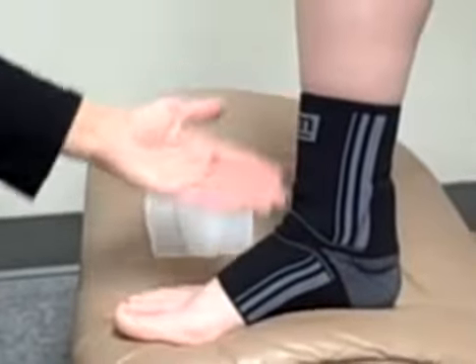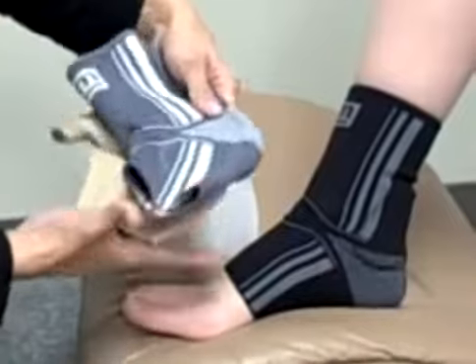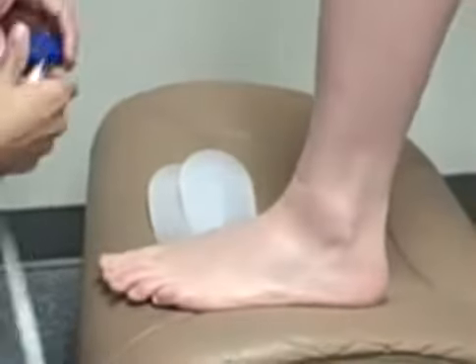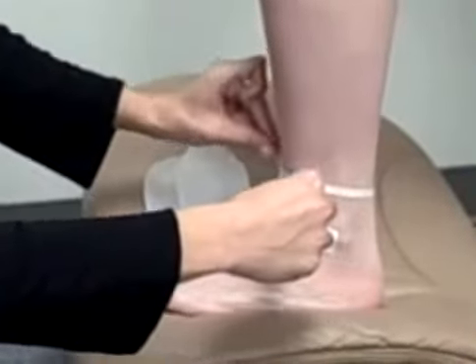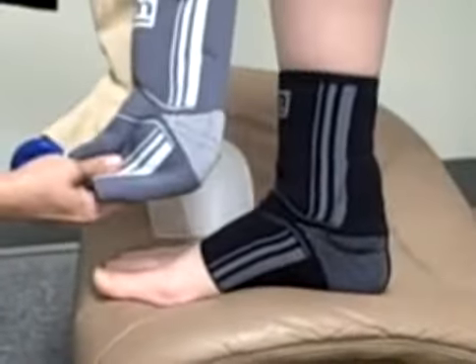This support is available in this black color as well as a silver color and a sand color. In order to measure for this product, you take a very simple ankle measurement around the smallest part of the ankle. Find your measurement and then look at the chart to determine the best size for your patient in the Acumed Medi Achilles tendon support.